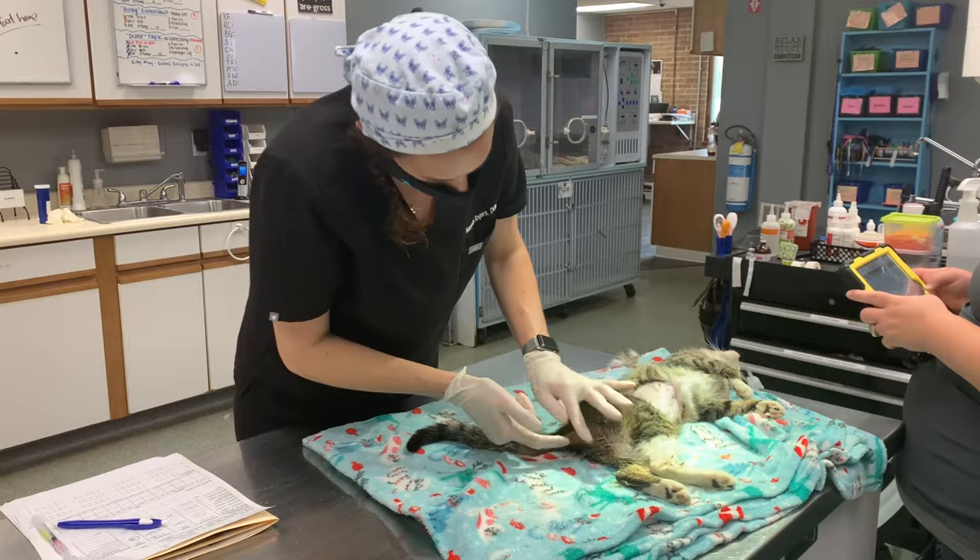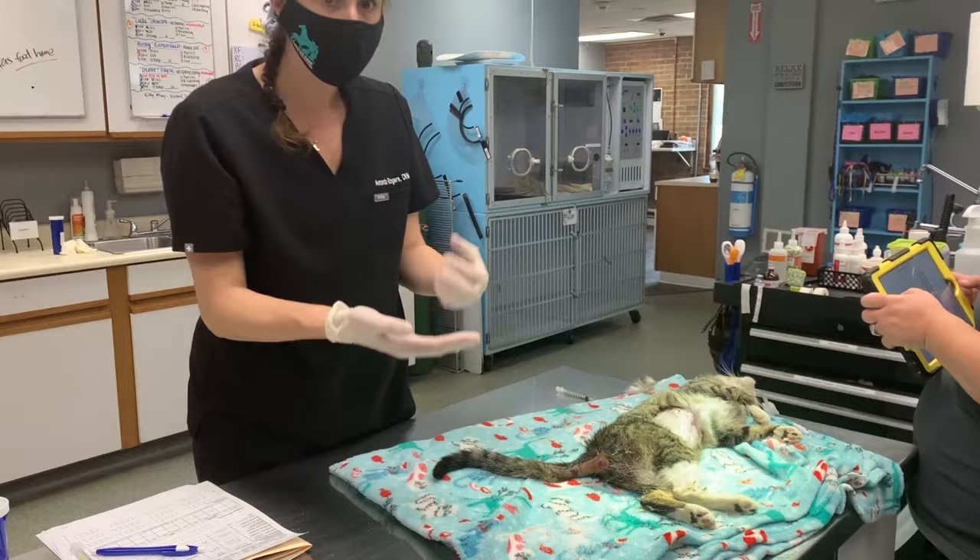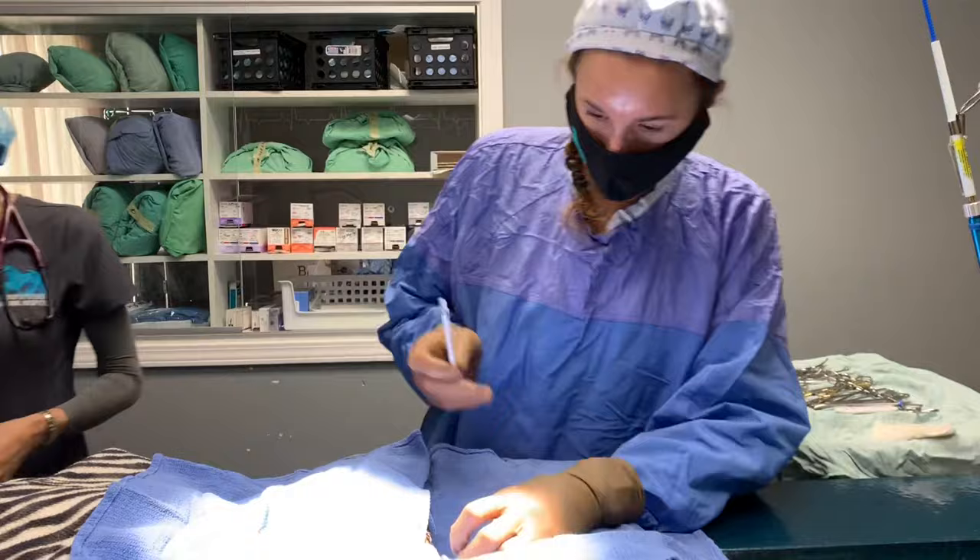I'm going to be in the abdomen here in a second so I can take a look. But we're also going to put a purse string in there because if you don't, that will re-prolapse. So we're going to spay her — which is the sterile part — and then I'll put a small purse string in here. You can see how nicely that went in once we have it lubricated properly and we've got some of the swelling down. So we're going to move her to the OR now.